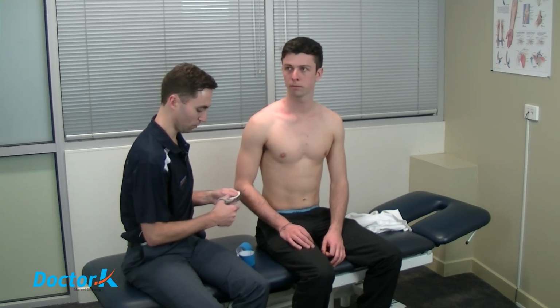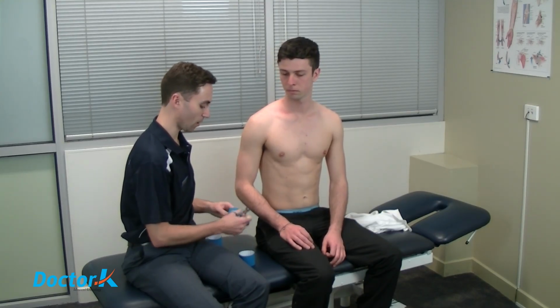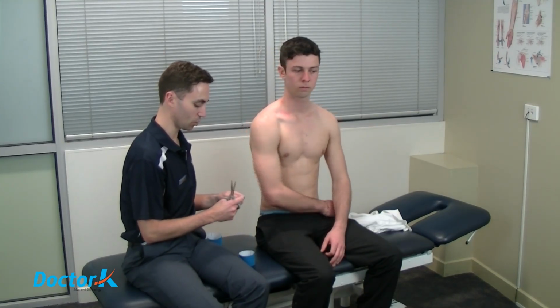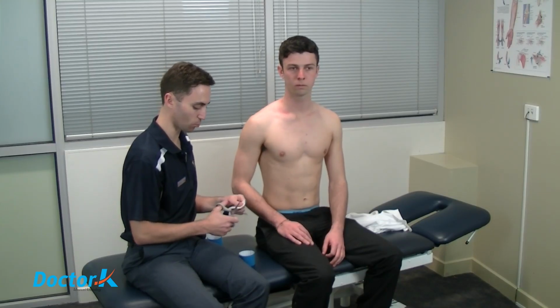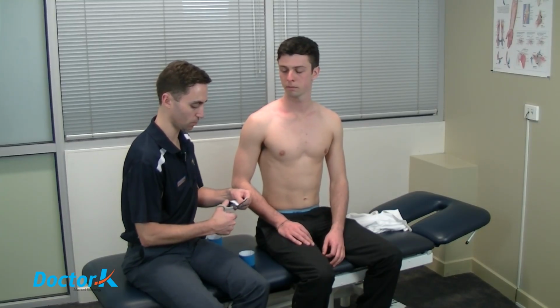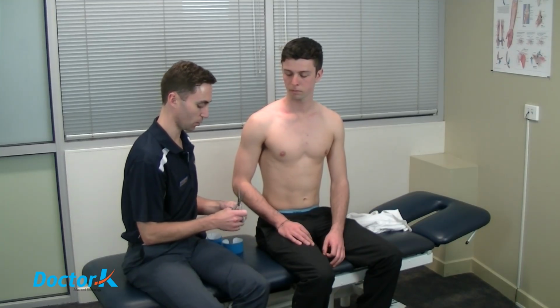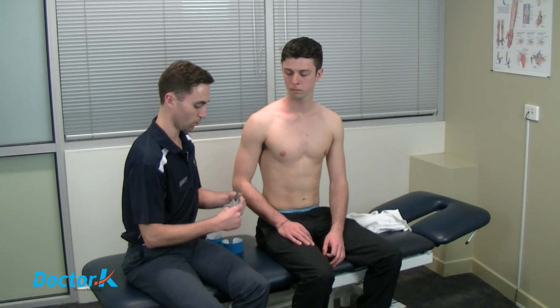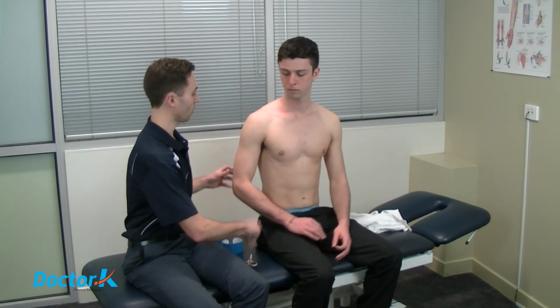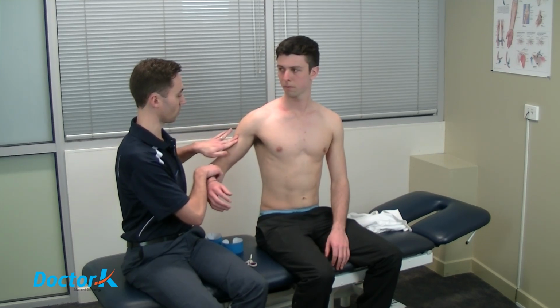From a positioning point of view with this taping, we want to try and position your shoulder to allow for a lengthening of the tissues around where you're applying the tape. So it'll mean that you need to actually change the position of your shoulder throughout the taping technique. So for example, when you're doing the first piece around the front of your shoulder, we're going to need to have your arm outwardly rotated. So for our piece coming this way, we're going to have it reaching out to the side to some extent.